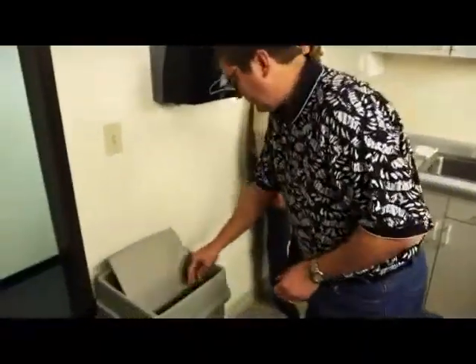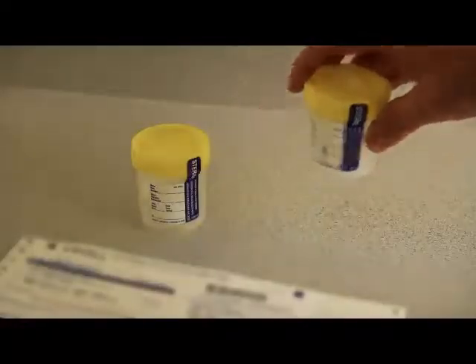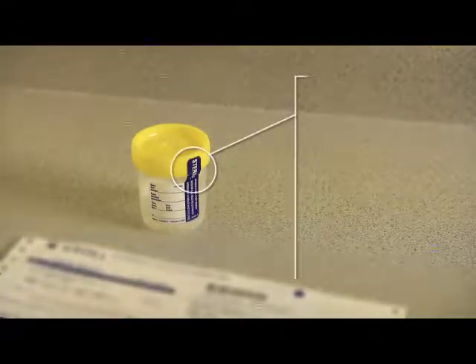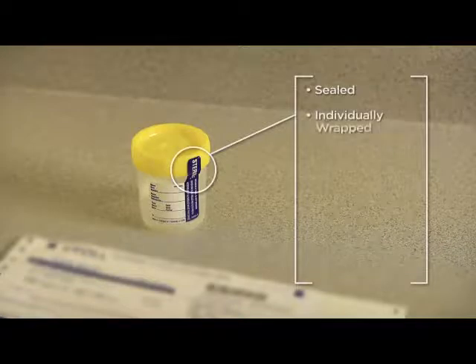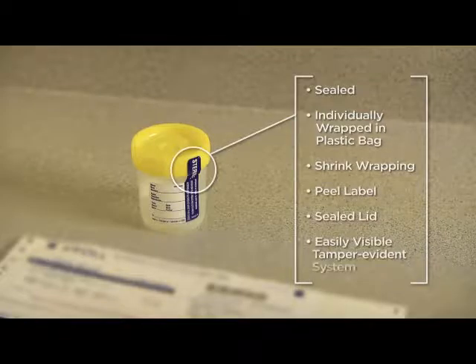Either give the donor or allow the donor to select the collection kit or collection container, if it is separate from the kit, from the available supply. Even if the collection kit is sealed, the collection container must still be sealed or individually wrapped in a plastic bag or shrink wrapping, or must have a peel label, sealed lid, or other easily visible tamper-evident system. Do not unwrap or break the seal on any specimen bottle at this time. Unwrap only the collection container.